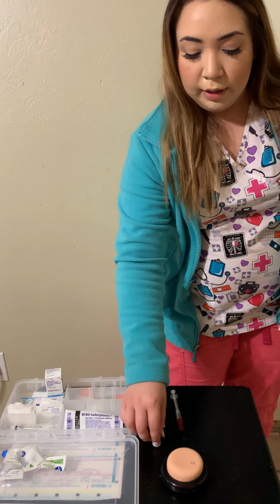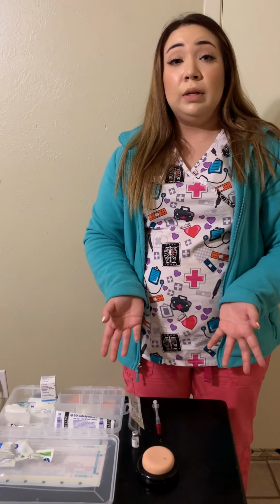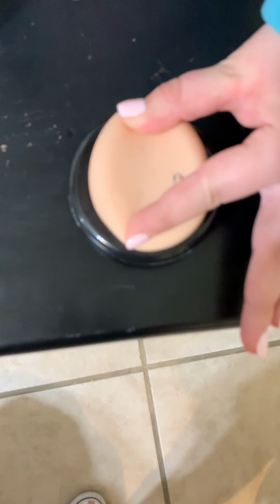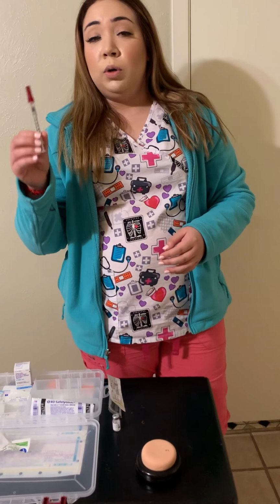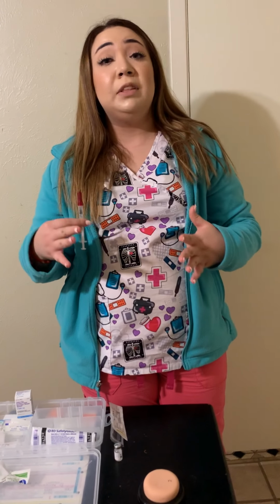Okay, so we go into our client's room, or, like I said, we prepare this in our client's room, so their skin is already dry from that alcohol pad. We're going to now ask our client to just stretch out their arm, and we're going to just taut their skin like so. We want to, again, make sure the area is free of any kind of vein or artery. So it is important when you are administering this or inserting the needle into the skin, you want to make sure you go in at a 10 to 15 degree angle.